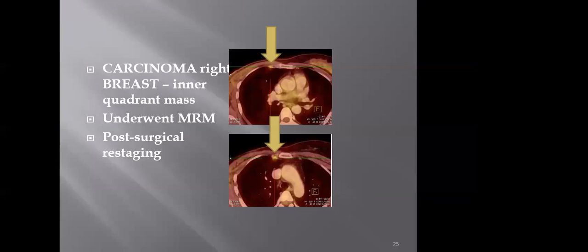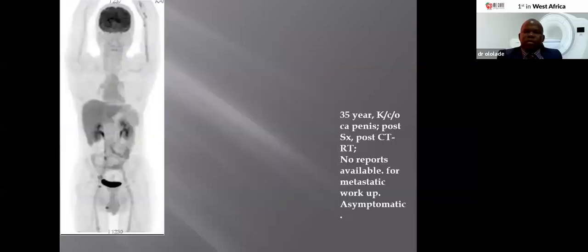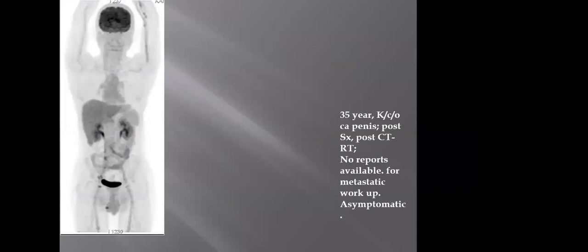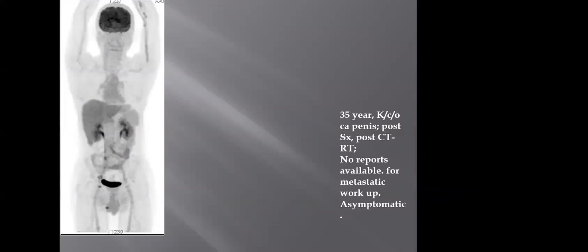Now, this node can very well either be a metastatic node or it can very well be just a reactive or an inflammatory node. This is where the PET scan can get foxed, where the appropriate pre-treatment imaging is not done.